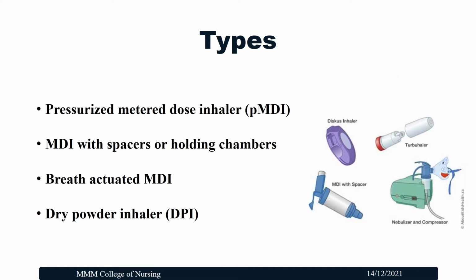There are different types of metered dose inhalers available. The conventional method is the pressurized metered dose inhaler, then the metered dose inhaler with a spacer or holding chamber, the breath activated metered dose inhaler, and dry powder inhalers.